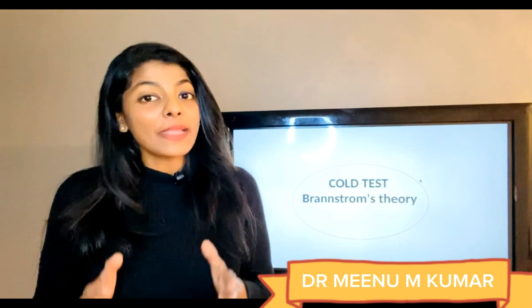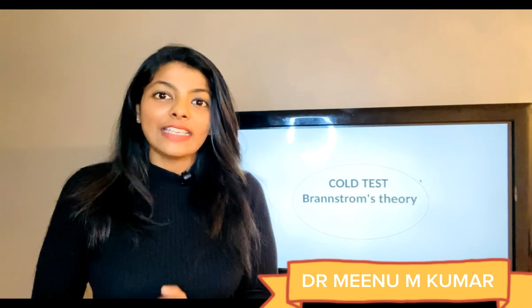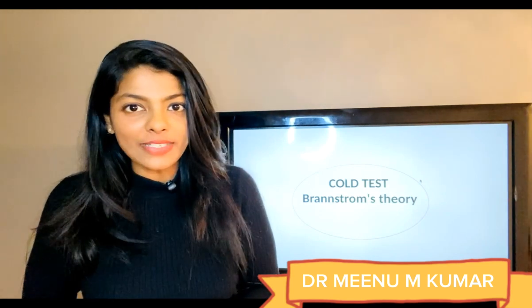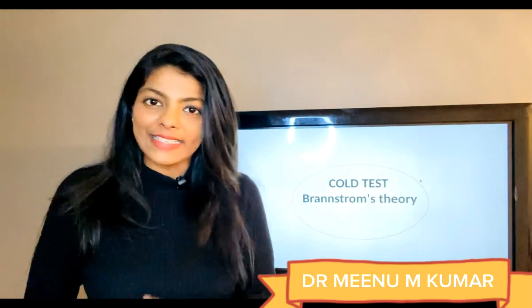So now coming to the mechanism of action of the cold test, which is explained by the Brännström theory. That is, when the cold is applied, there will be contraction or the outward movement of the fluid in the dentinal tubules, which causes an increase in the intrapulpal pressure. And as a result of this, the following responses are seen.